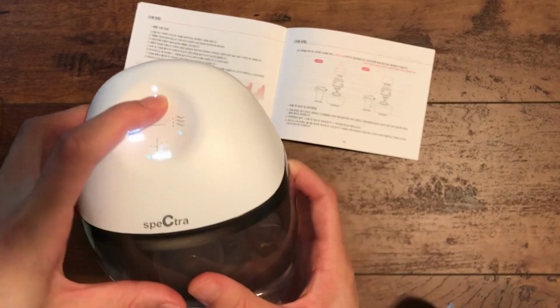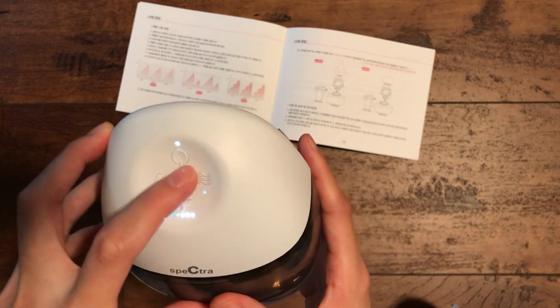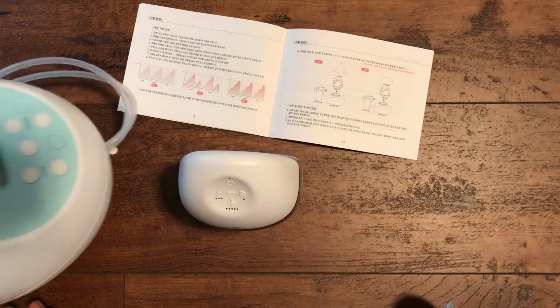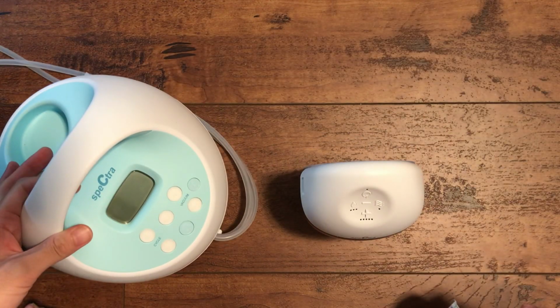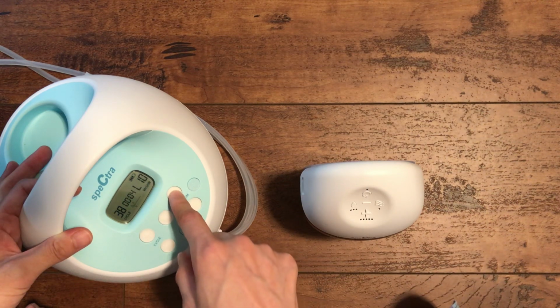And then in terms of the intensity, I use level 3 for both massage and expression mode. I think that's the safe middle ground. I don't want it to be too intense to the point where it's hurting my nipples. But it really depends on your preference. The reason I went with 3, which is in the middle, is because with my Spectra S1, which I use as my main pump at home, there are 12 different vacuum levels. Let me double check that. So you can have level 1 all the way through level 12.